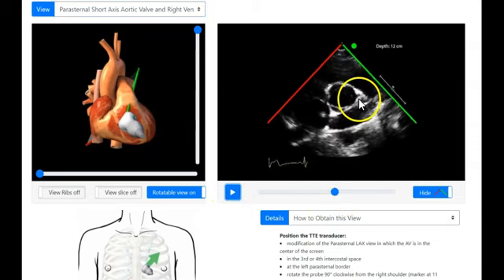And see this little mark right there, little cut in right there. That would be, we see right, left. That's the ostium to the left main artery right there, which is going to divide into the circ and LAD there. But that's the left main right there. And you can sometimes pick up the right side as well.